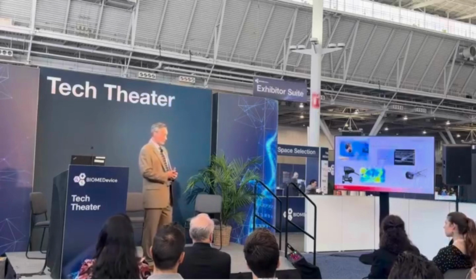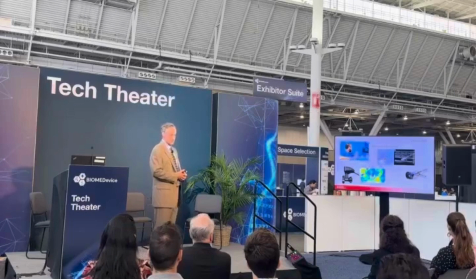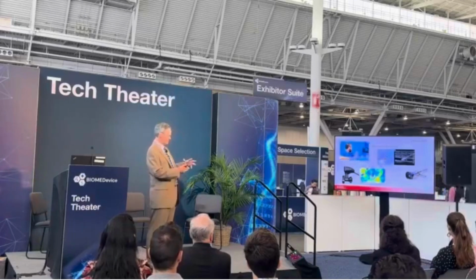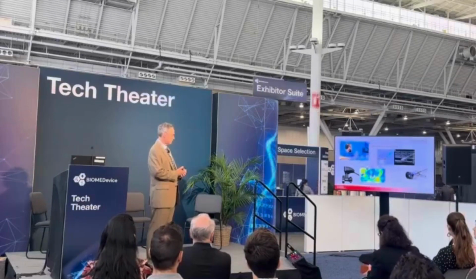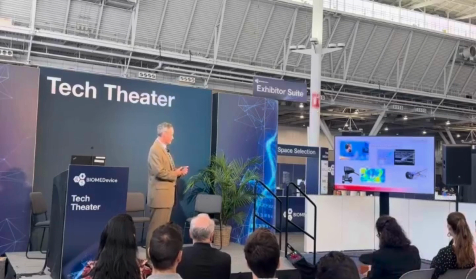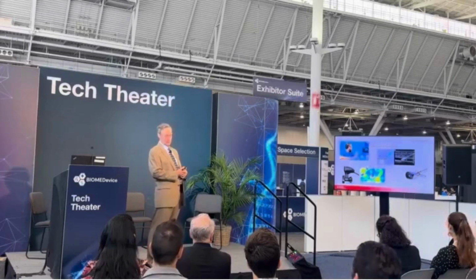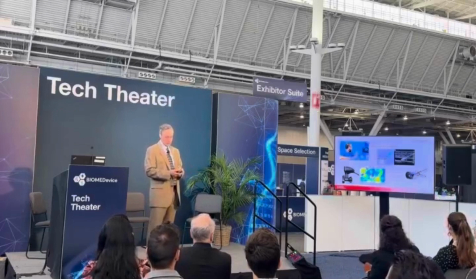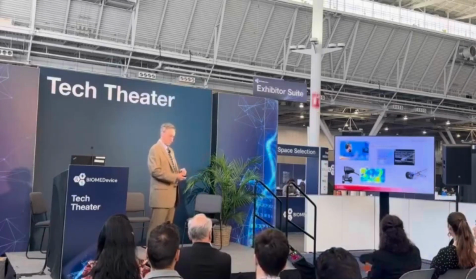Some other technologies are certainly worth noting. Ultrasonic guidance is another form of visualization. It's sort of like an MRI/CT image of, in this case, a needle going into a vessel. And there's a local company called Active Surgical, which is doing some pretty interesting stuff, where you can actually see the degree of perfusion in an organ and see the blood flow on the screen. So check that out.